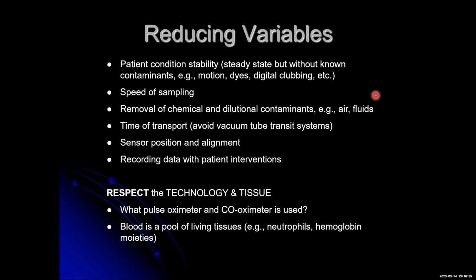And in reality, some places really rely on these devices, so much so that they qualify individuals for when they get oxygen, when they can go home. A baby being released from a NICU has to be checked off in their car seat with a pulse oximeter before they can go home.